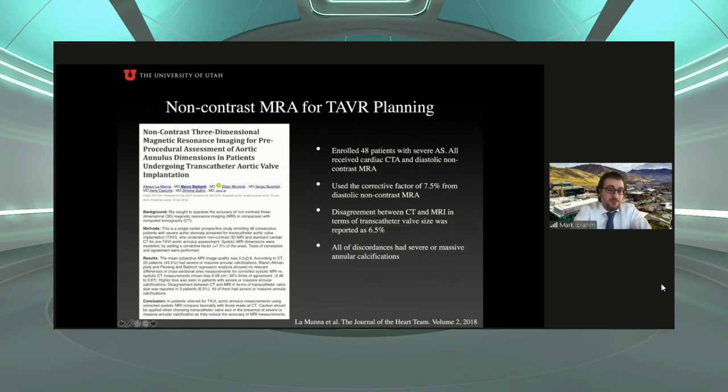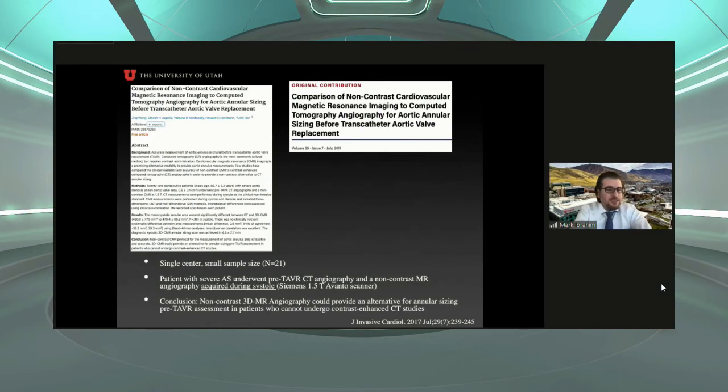And there have been discordances among the readers, and the majority of them were when there was massive calcification. So again, I don't know how reliable these measurements were and how confident the interventionalists would be proceeding with valve implantation. Finally, there was a study that did the actual systolic acquisition and validated it against the cardiac CTA with decent results here.